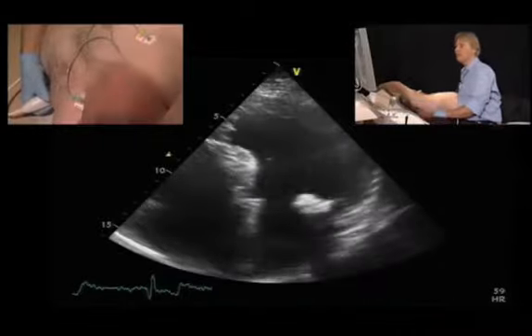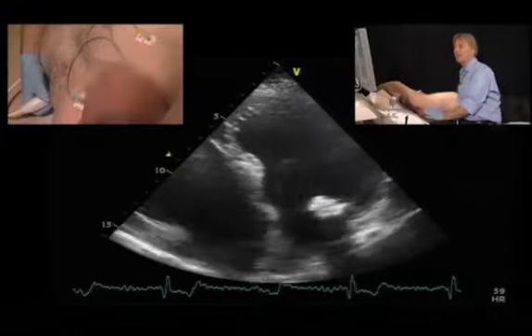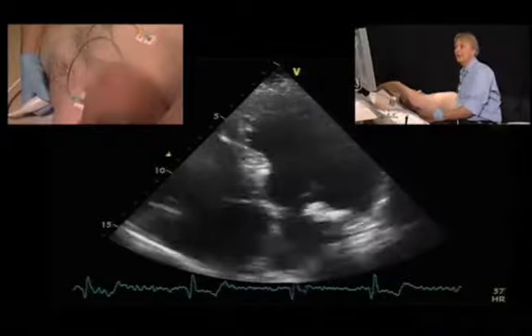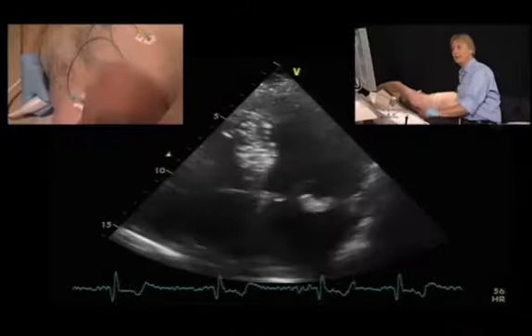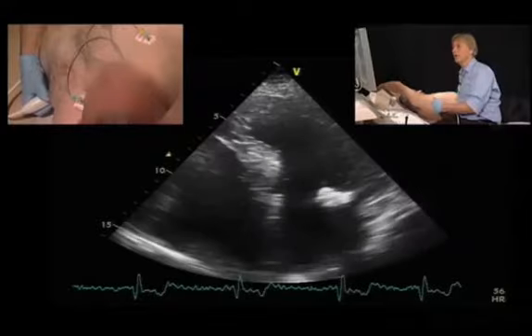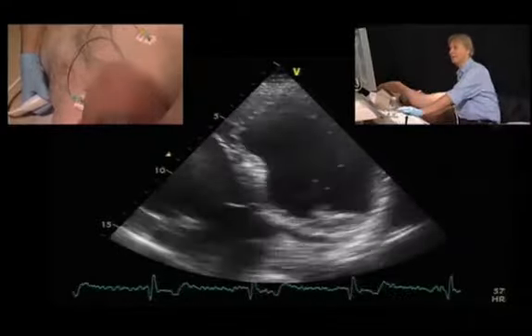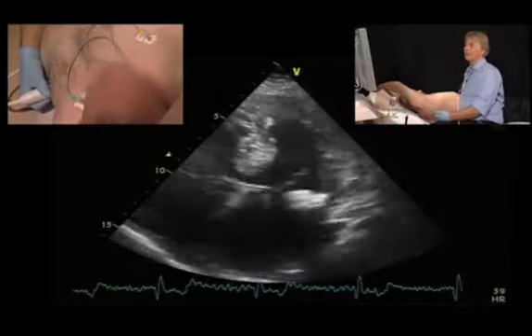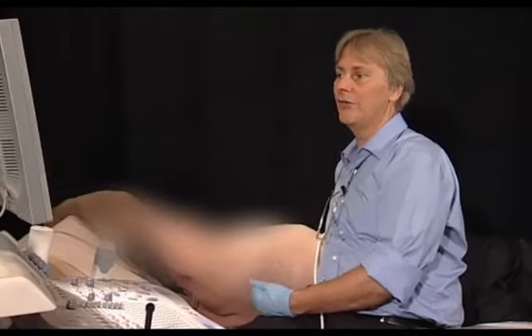Now, one thing which is important to know, if we do not have the information that the patient is afebrile and that he does not have any signs of infection, this could also be active endocarditis. We do see patients with very similar masses who had endocarditis, maybe ongoing endocarditis, for weeks or months, and within such a mass we still have active infectious material. So in summary, here is a patient with the sequelae of endocarditis of the mitral valve.